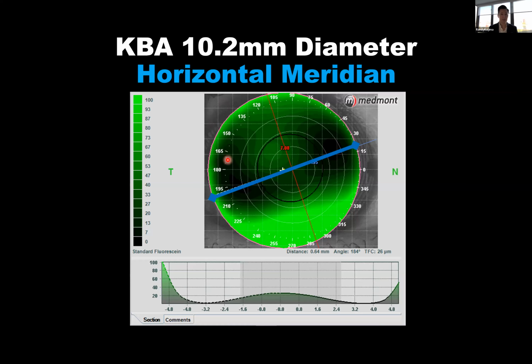And let's see how this is fit. Across the flattest meridian of the eye, the meridian that has the highest elevation on opposing sides, we can see the lens landing down at around 830 and around 230 right here. And you notice with the way this lens is designed, you get this very wide, soft landing. See how the lens comes toward the surface in a very shallow manner, distributes its force over a wide area before creating a healthy edge lift.